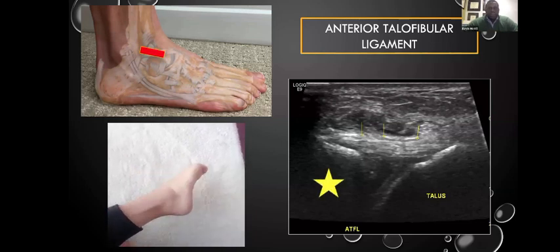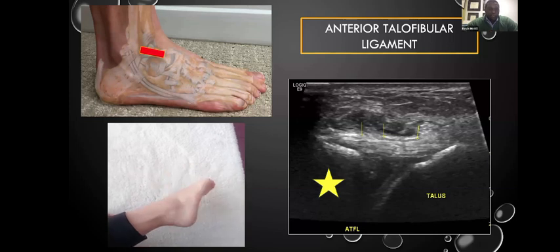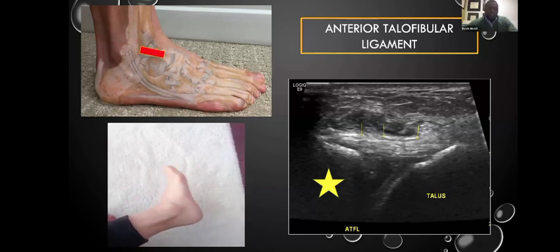And so here we have a star. Whenever I'm discussing ultrasound, I often put a star somewhere on the image to denote what I call the North Star. The North Star, for me, is essentially an area on the body where something you can see visually, you can also palpate.